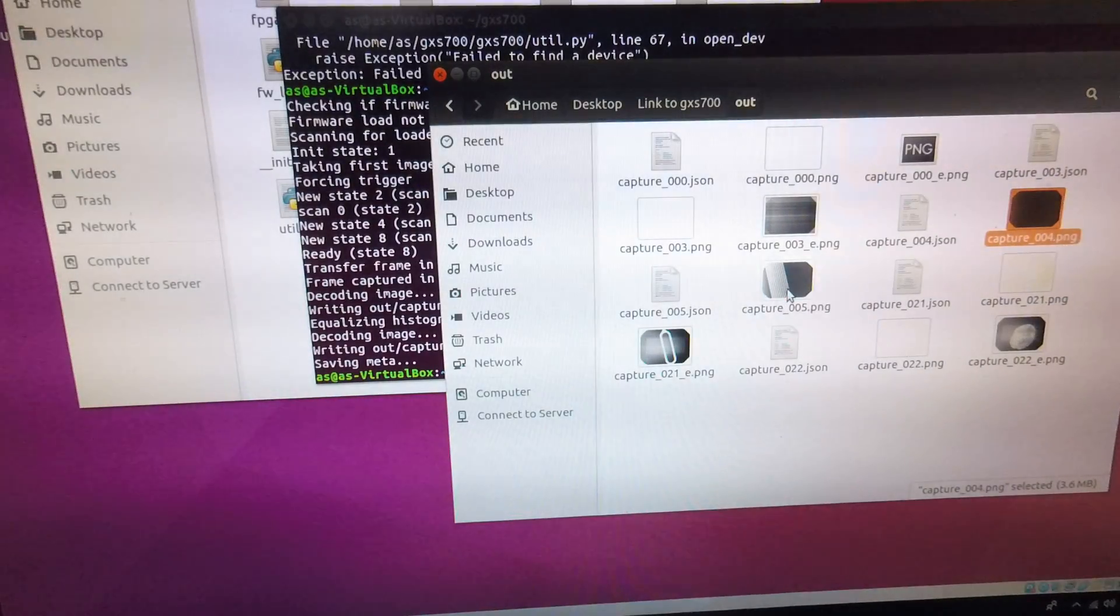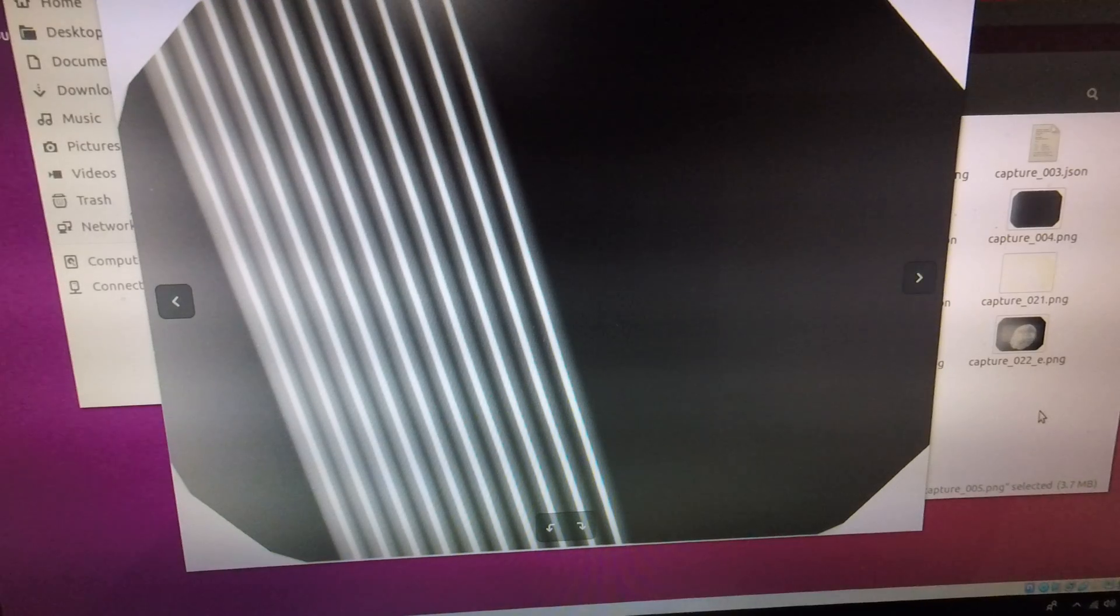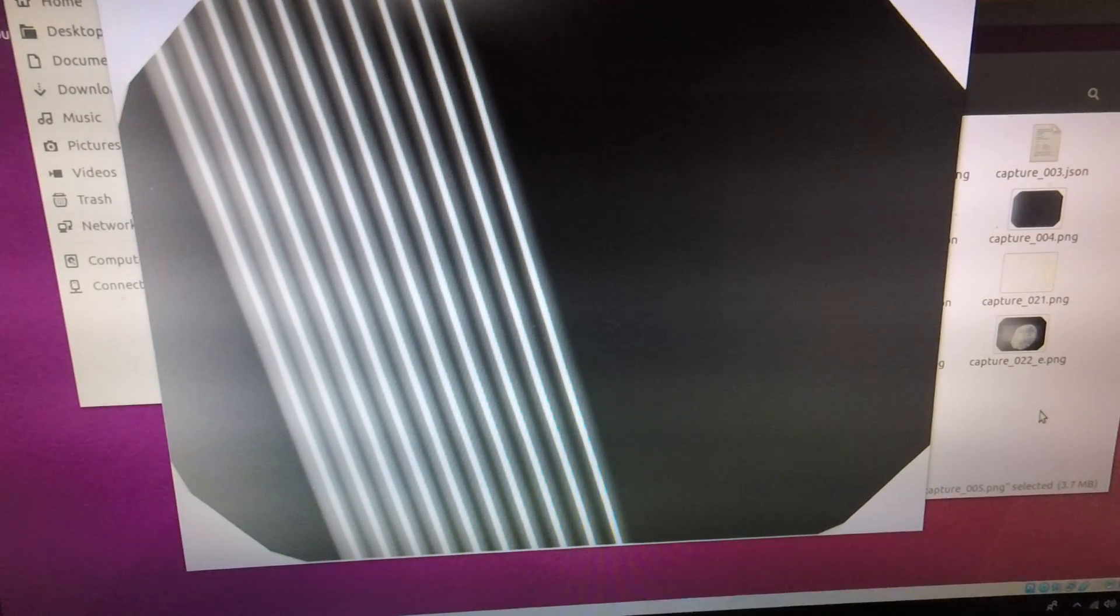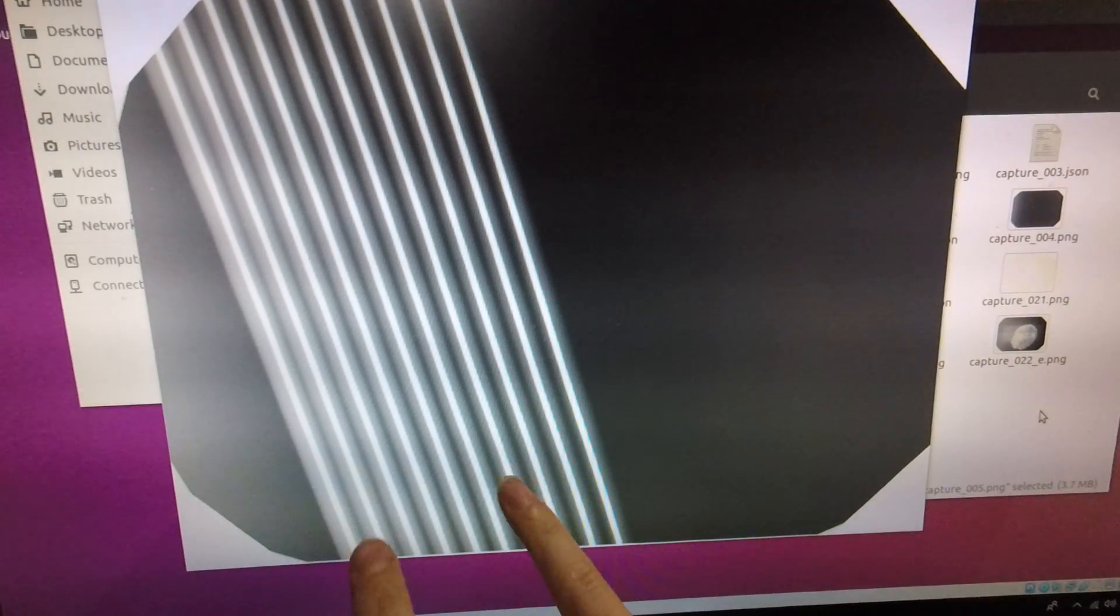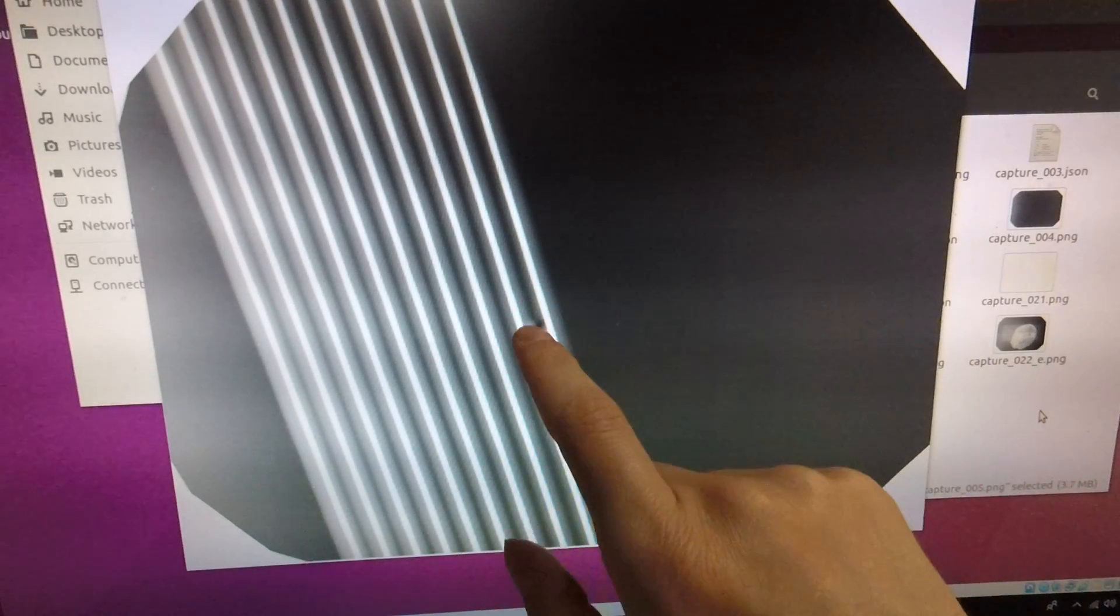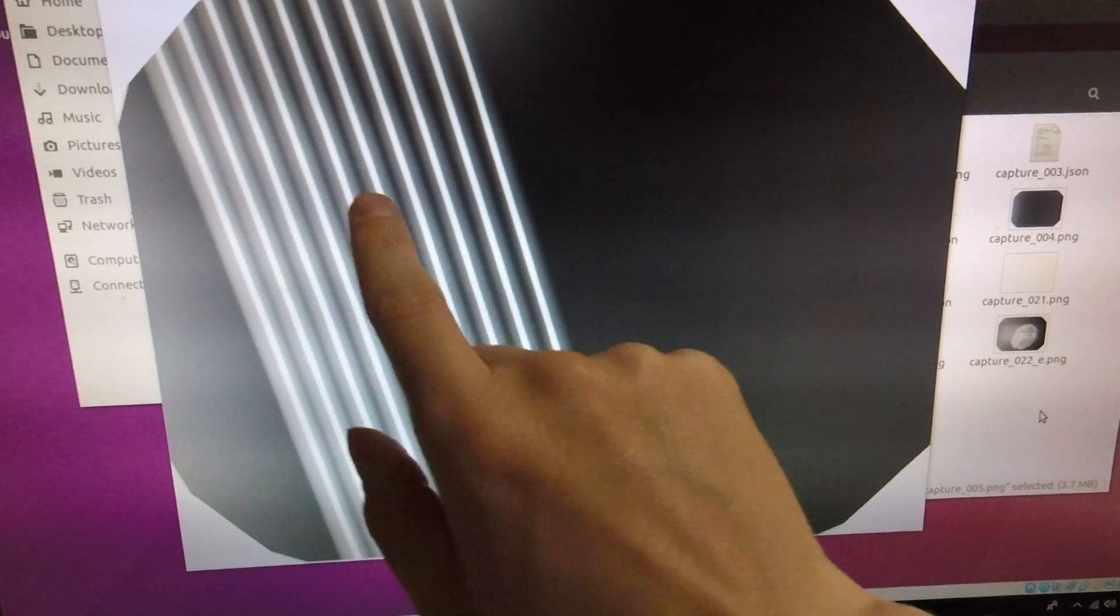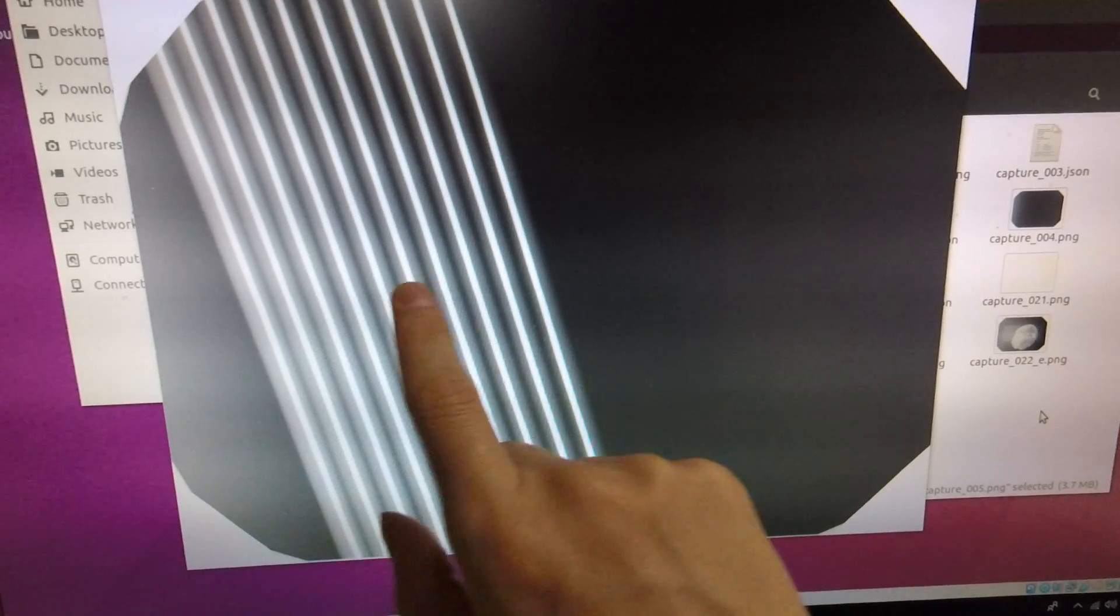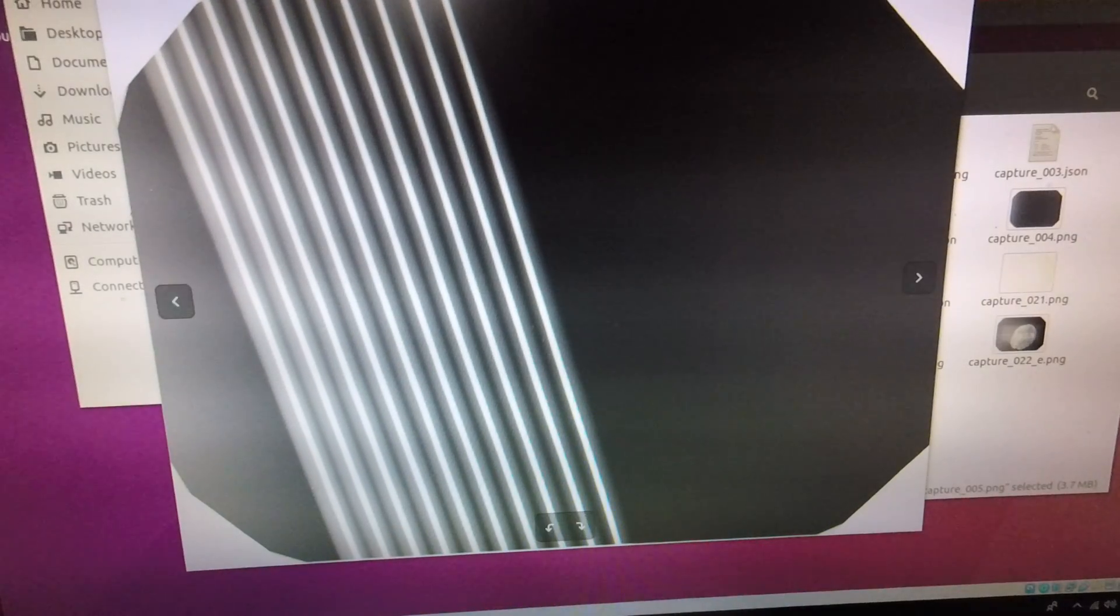Now if you were to put something on the sensor this would be a ribbon cable on the sensor and then that's x-rayed. The dark white is the actual metal conductors in the ribbon cable and the lighter white is the absorption by the insulation.